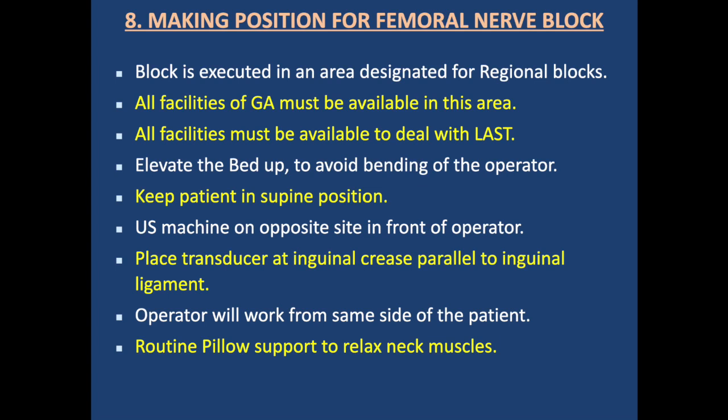Block is executed in an area designated especially for regional block. All facilities of general anesthesia must be available in this area. All facilities must be available to deal with local anesthetic systemic toxicity. We elevate the bed up to avoid bending of the operator. We keep the patient in supine position.